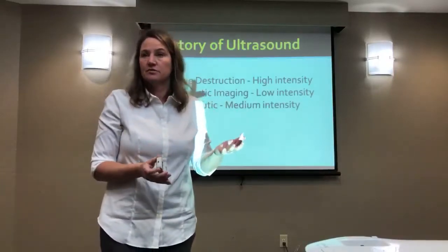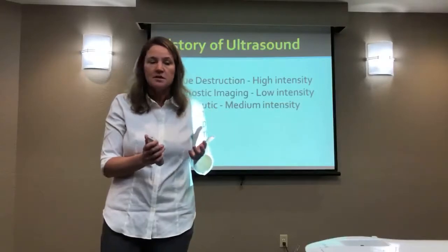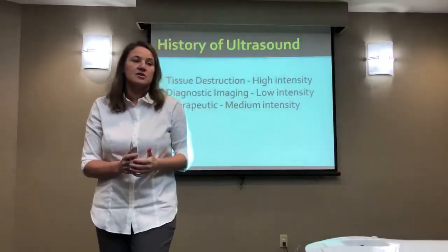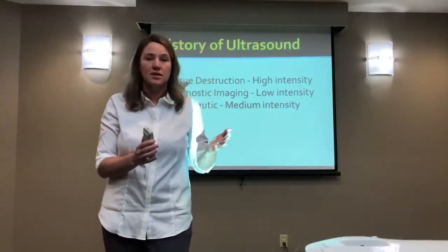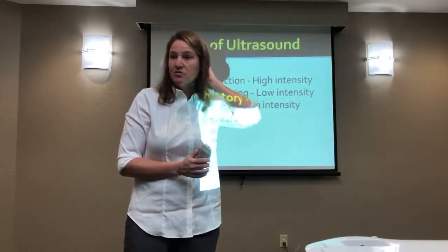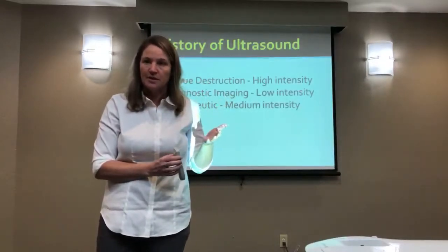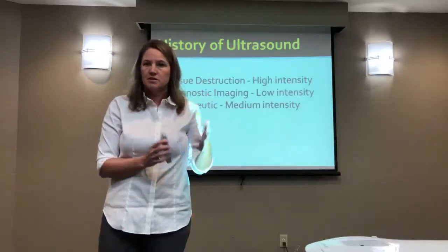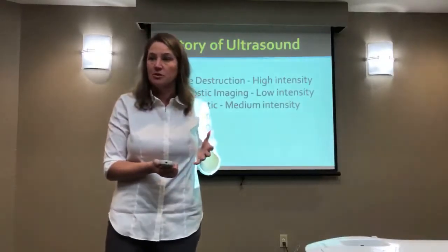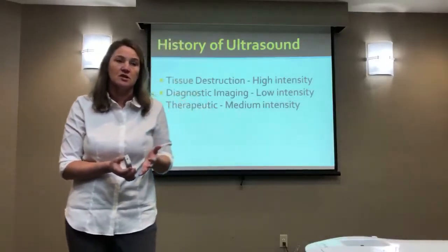And you don't feel ultrasound. When a certain amount of ultrasound is entering your body, there's no sensation and no visible response until it begins to reach harmful levels and becomes painful, noxious levels. So that's what was happening here: they weren't aware of it until it became potentially dangerous. As it turns out, one of the methods of using ultrasound is for tissue destruction and doing damage. It's actually used for that purpose, especially with cancer treatment, to make tissue vulnerable, combined with other methods. We're not using it for that reason, but the potential is there. With enough ultrasound energy, you can harm tissue. That's the reason it's a skilled intervention, and at certain intensities and frequencies you have to be cautious because you could cause harm.